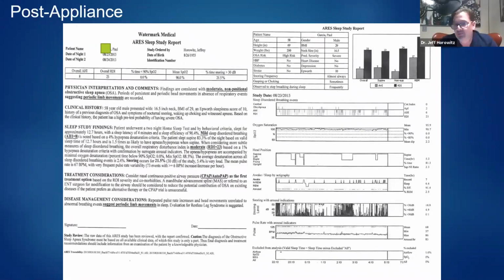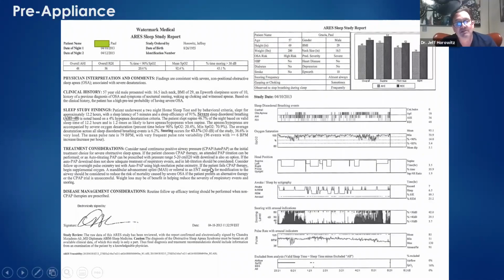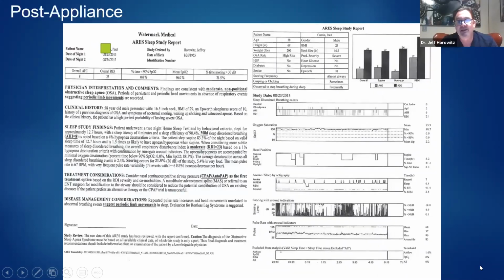So we put them through appliance therapy based on the risk factors that we found. So we got them this comprehensive diagnosis signed by a board certified sleep physician. If you go to the last test, that was his diagnosis based on the fact that we saw risk on the cone beam. We get a signed sleep study saying that oral appliance therapy was indicated.